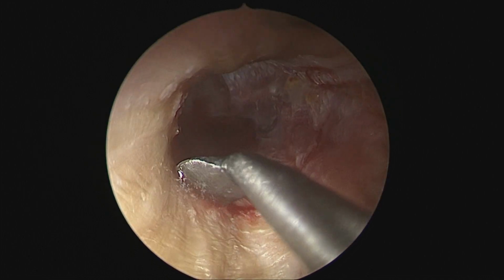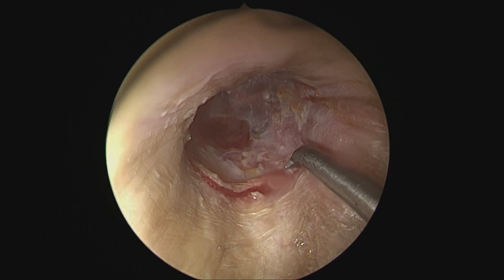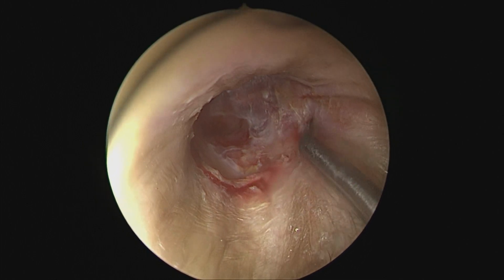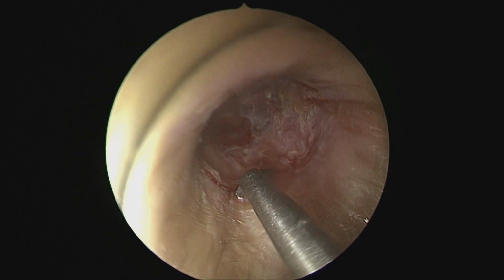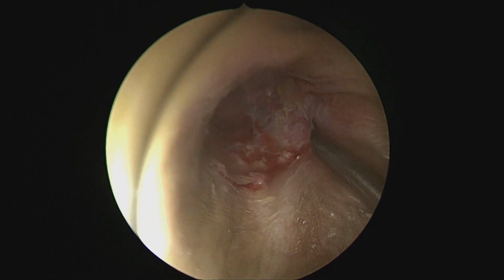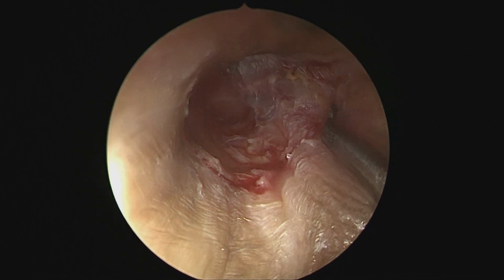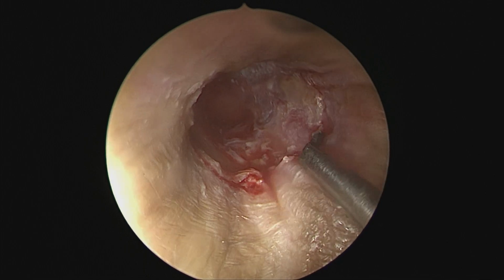It has to be borne in mind that the posterior superior canal skin is often thick, as we are used to encountering that in standard postaural incision. However, in a totally transcanal approach, we might need a few strokes that are right on the bone to be able to create a plane for comfortable flap elevation.